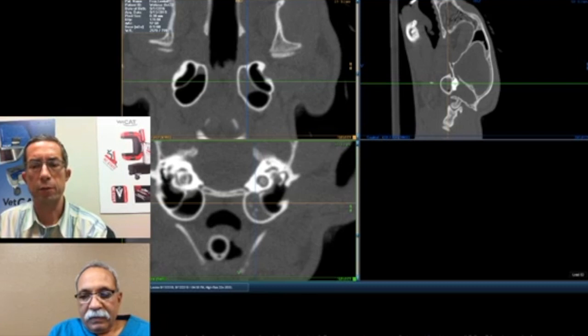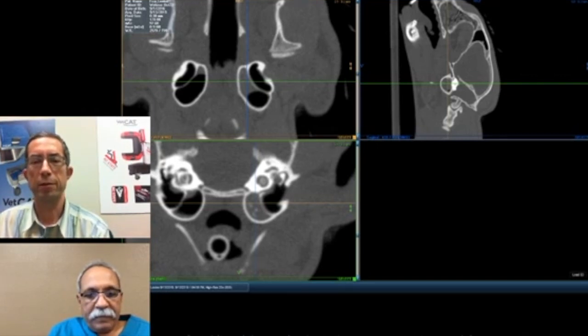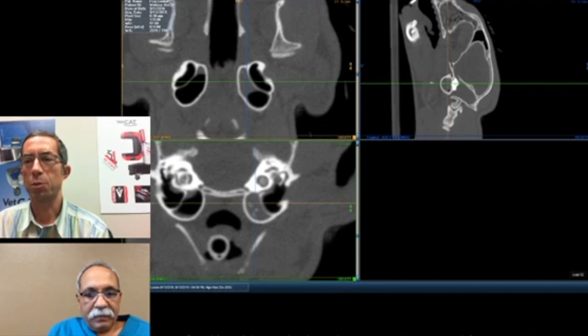Thank you very much for this quick overview. I know you've spent years studying ear anatomy and approaching it surgically. There's a lot more to say, and it looks like the availability of the CT scan with high resolution has allowed you to diagnose this more precisely and approach these cases probably surgically a little differently than what you used to do.